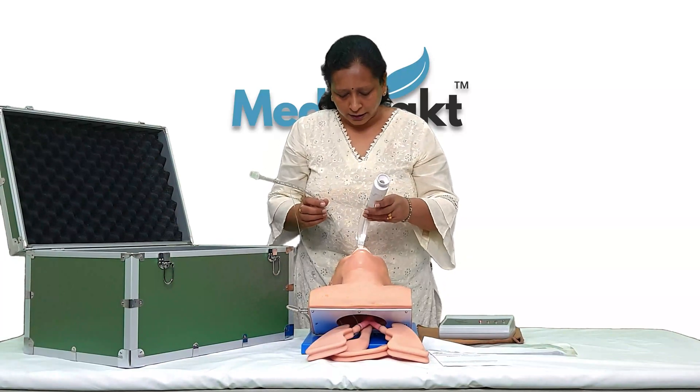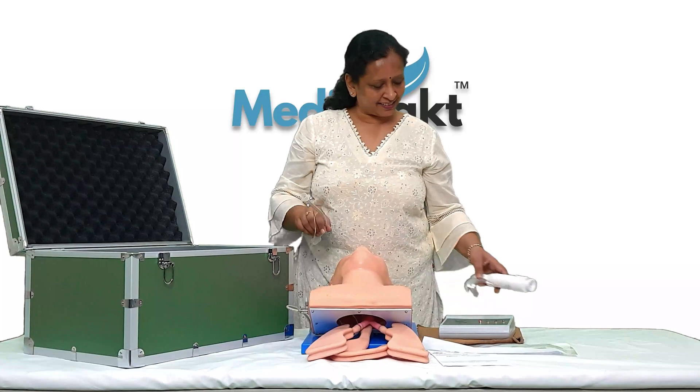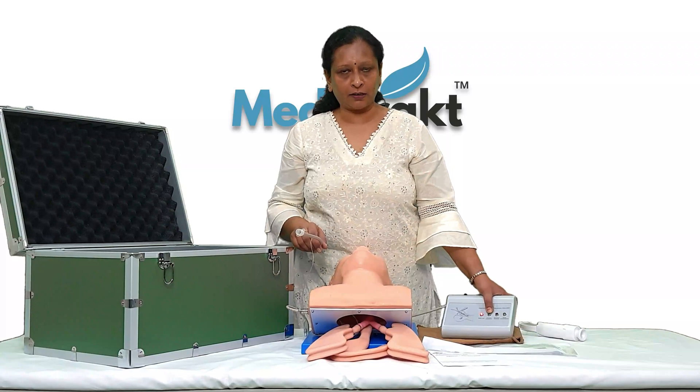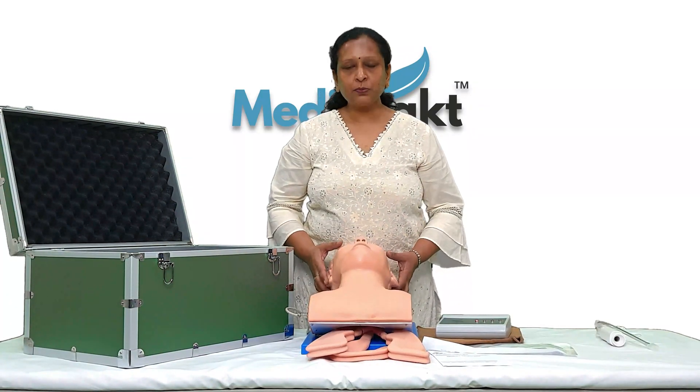I'm not a professional person to do the correct intubation, so you can do it correctly. I can just tell you that if the intubation is correct, this green light will blink — then it will be correct.